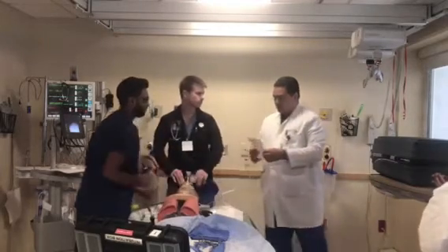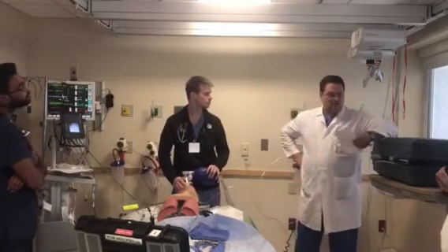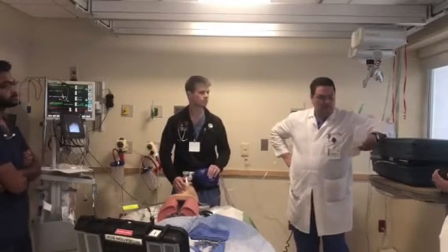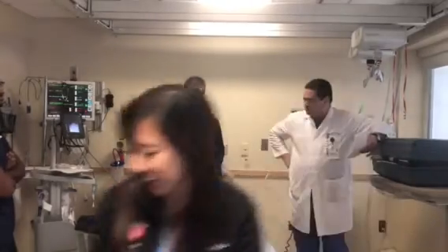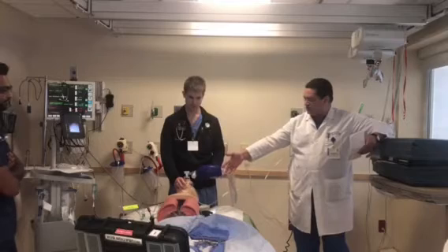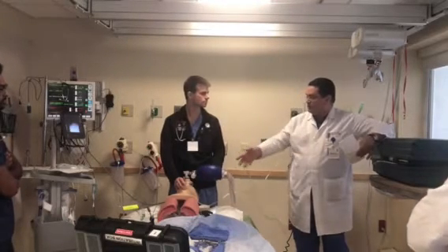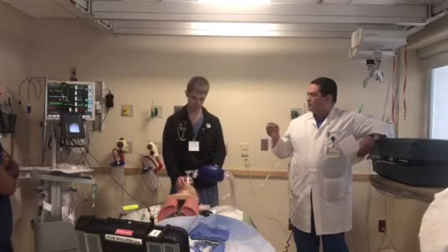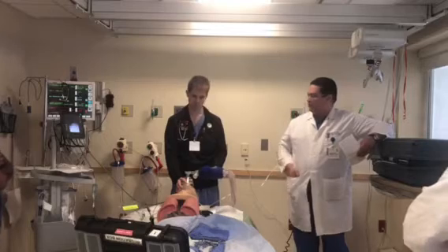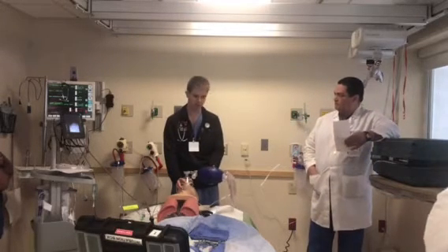Okay, so now the patient's saturation is low. We can't ventilate the patient, right? So we did all of this, eight people holding the mask and everything, and we kind of got two breaths inside the patient, right? And the saturation now is coming up to like 88 or something like this. What are you going to do? So he still needs to be intubated. Yeah, it's a difficult intubation.